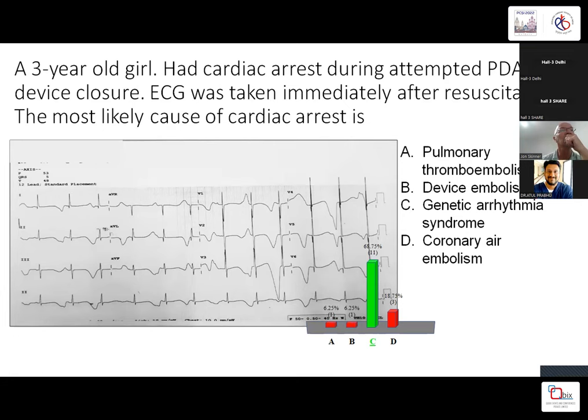Once repolarization dispersion is evident by a prolonged QT, then even within the repolarization you have heterogeneity from beat to beat. This happens because of the epicardial to endocardial block, 2-to-1 and alternans, but here it is much more. T is almost merging into the next P wave in many beats, a lot of electrical instability. The importance is that once you identify this more than long QT, it is a medical emergency. Any time this patient can have torsades, and should be managed aggressively with beta blockers, cardiac sympathetic denervation, correction of hypokalemia, hypomagnesemia.